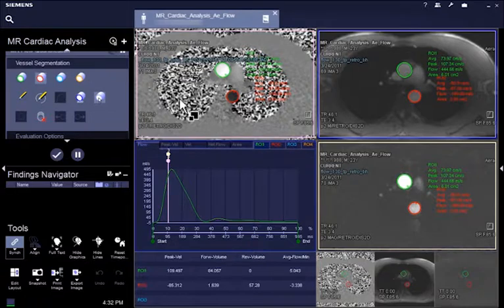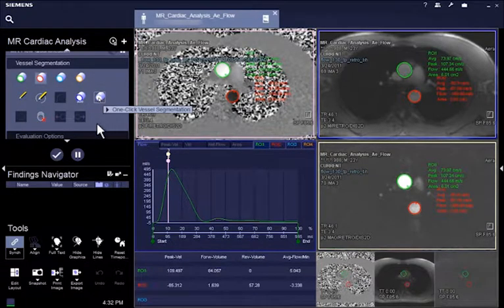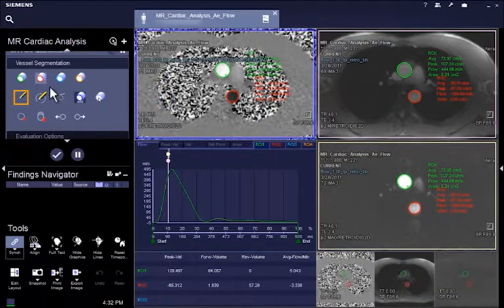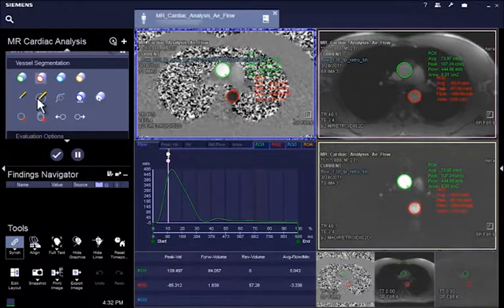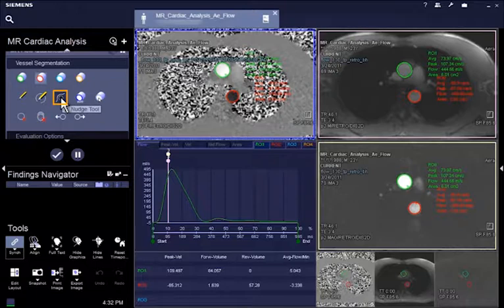Editing tools are available if you decide to edit the contours. Pen to define new contours, nudge tool to correct existing and active contours, or delete all contours.